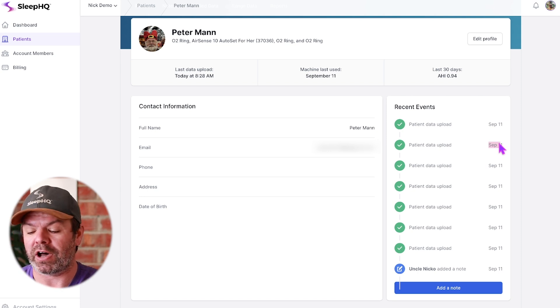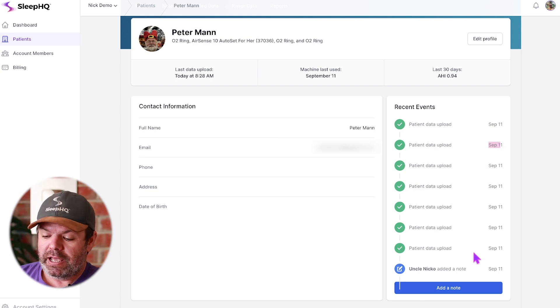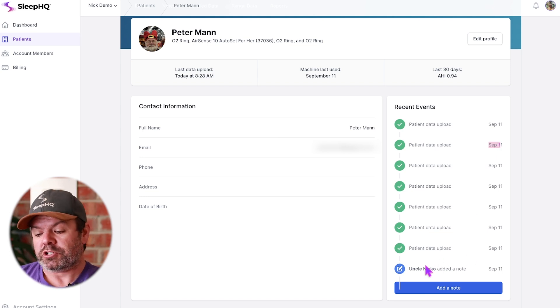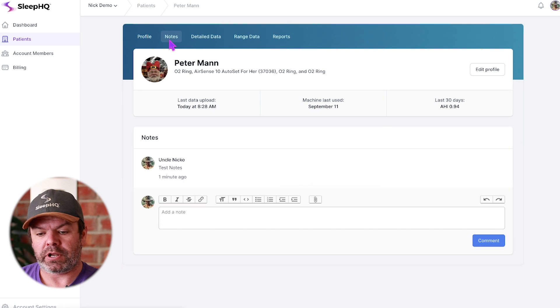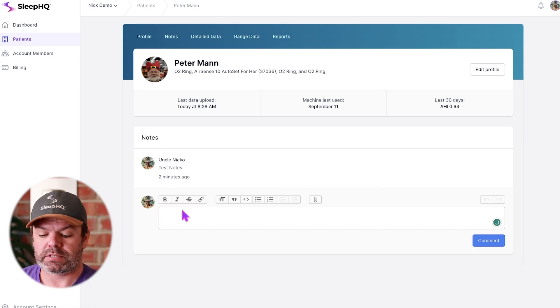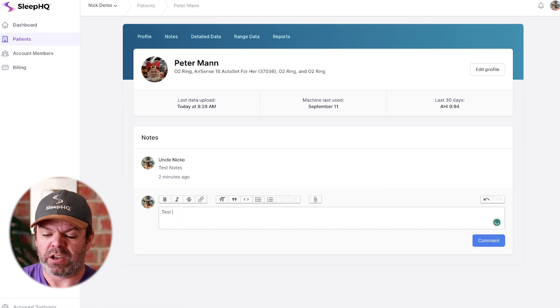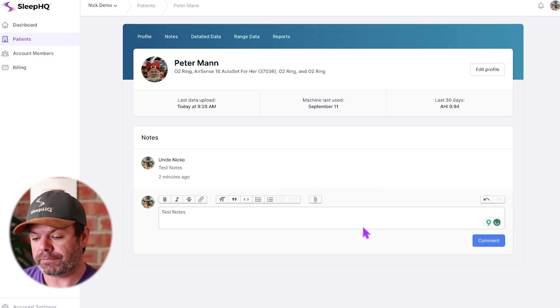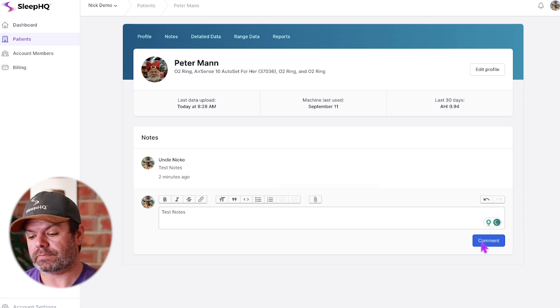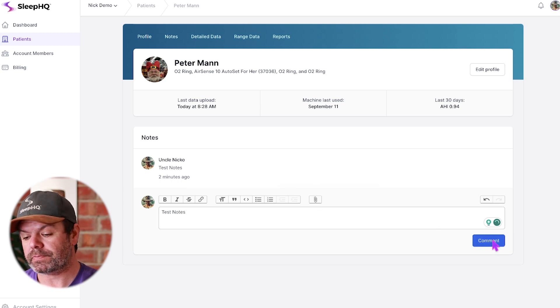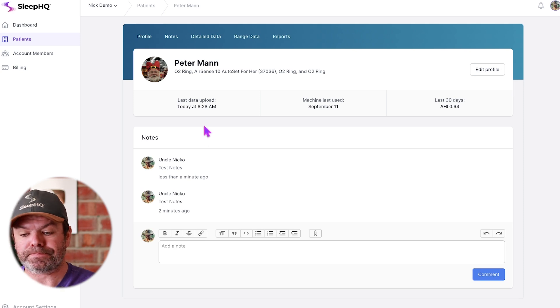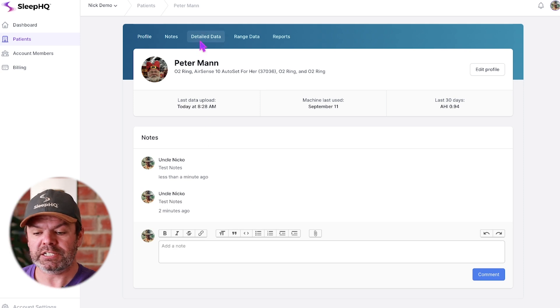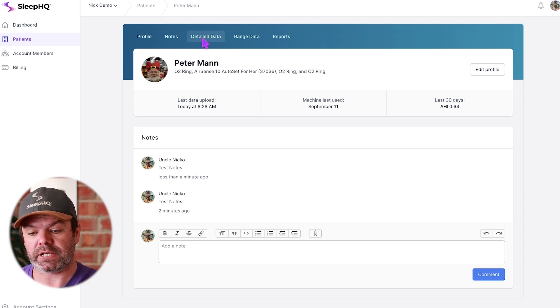If you're over there in the US and Peter's asleep here in Australia, you can log in and actually see Peter's data uploading throughout the night, which is pretty cool. It also shows when we're adding notes. We can add notes here, just come up to the notes tab, add notes like you would on any platform. You can attach files, click comment, and it adds a note.